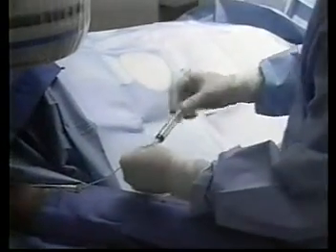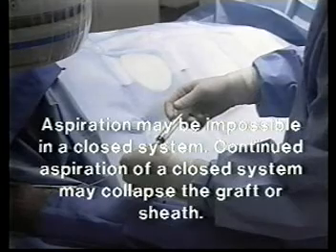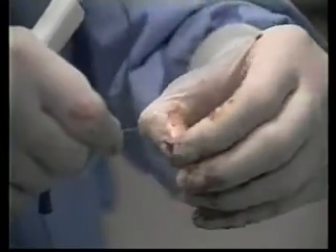When the 2 passes are complete, remove the device. Aspirate approximately 5 cc's of the homogenized clot via the venous sheath and discard the aspirate. Manually remove any accumulated fibrin from the fragmentation basket.